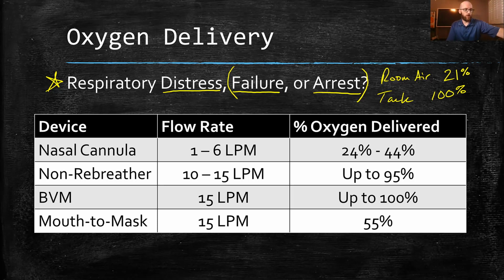Okay. In the registry world, not too often is the answer to the question nasal cannula. We don't see that utilized quite as often. But in the real world, so to speak, real world versus registry world or textbook world, we're not really going to be doing much in the way of nasal cannulas in the registry world. In the real world, you might do them a lot more often, or see people on them more often.